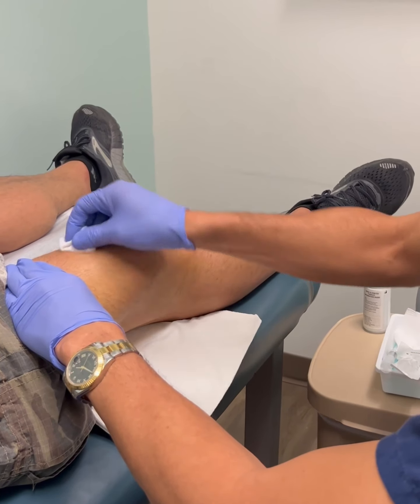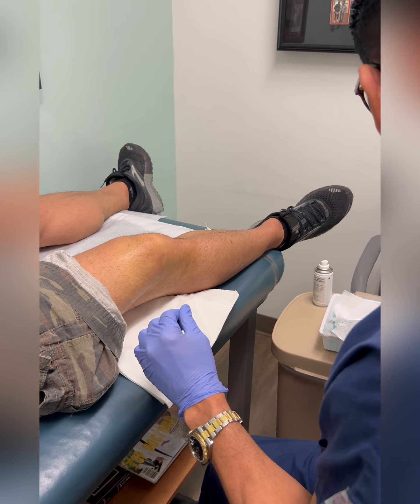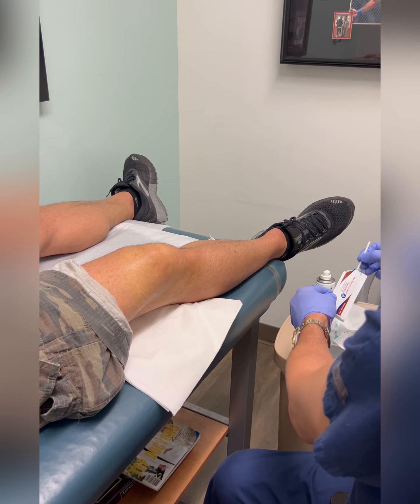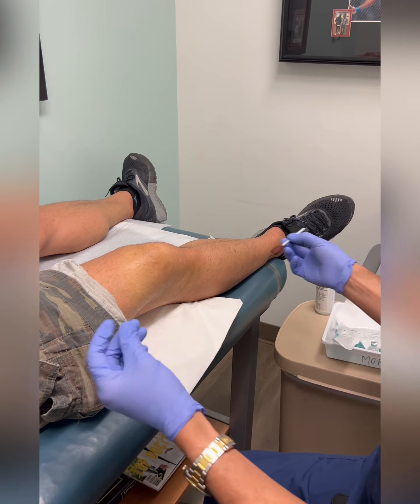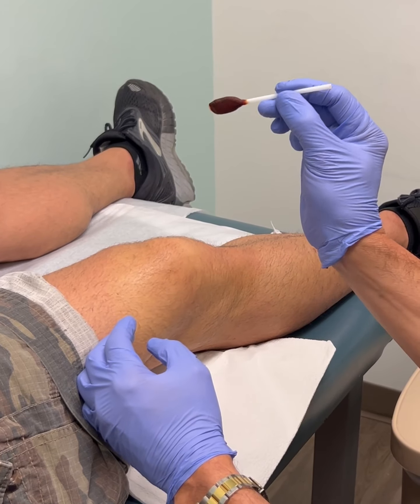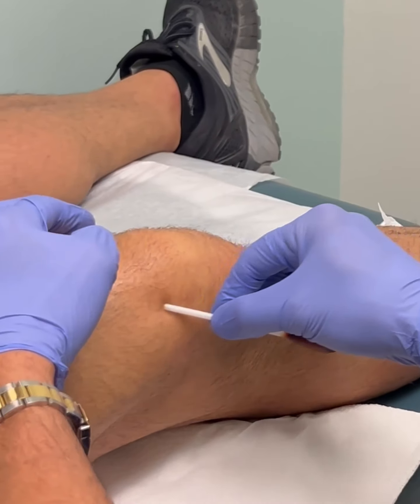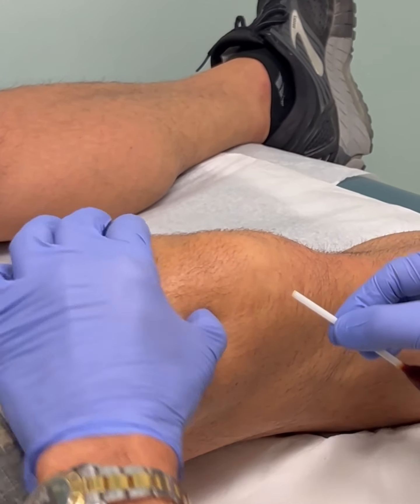I clean things as thoroughly as possible, because the worst thing that can happen after an injection is a deep infection — that would be catastrophic. It's going to be a betadine stick, and we have to outline our anatomy: we have the patella, the edge of the patella, and the quadriceps tendon.